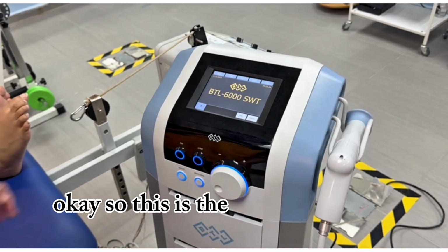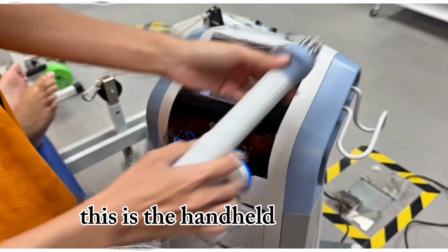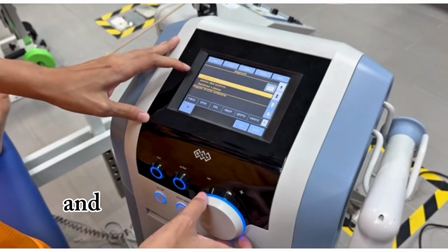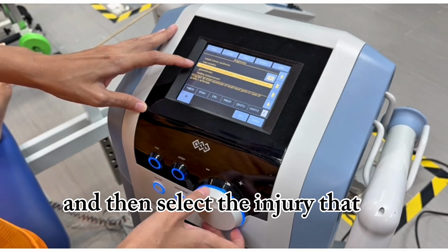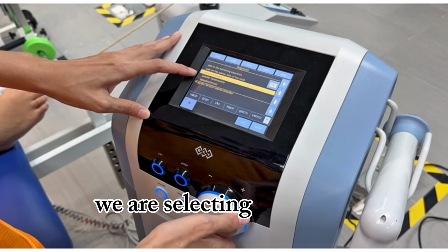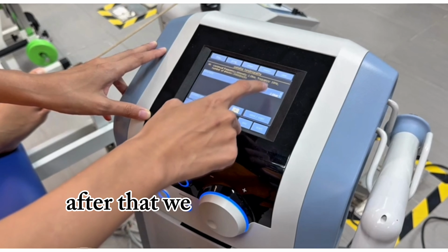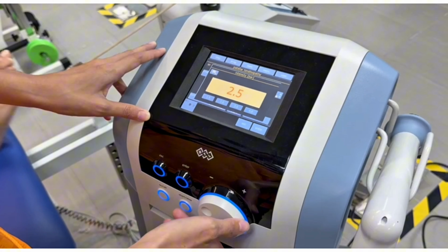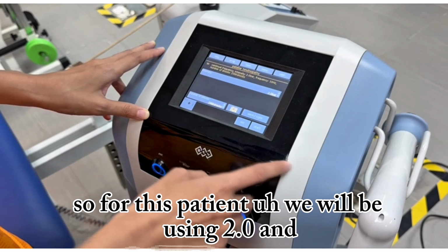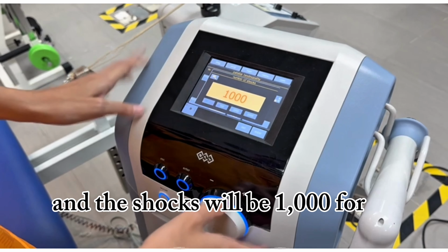Okay, so this is the radial shockwave therapy machine. This is the handheld applicator. Firstly, we will go to the menu and then select the injury that we want to treat. In this condition, we are selecting patella tendinopathy. After that, we can set the pressure in bar. For this patient, we will be using 2.0 and the shocks will be 1,000 for her condition.